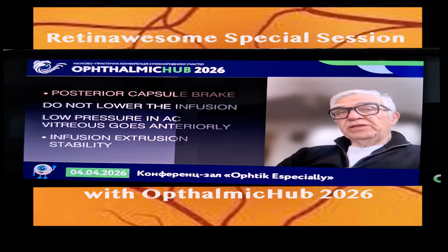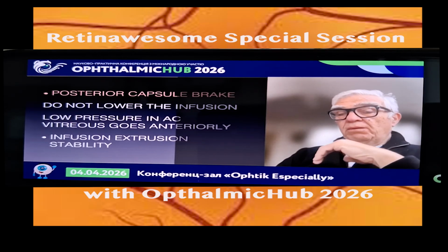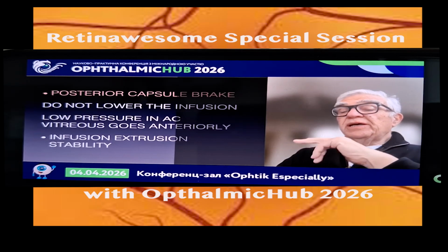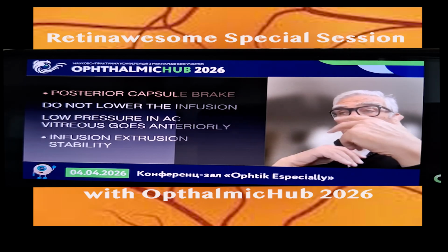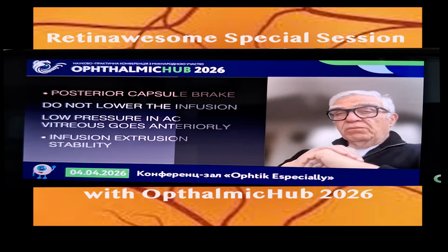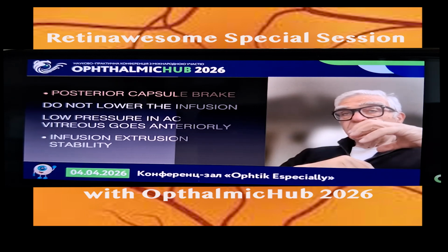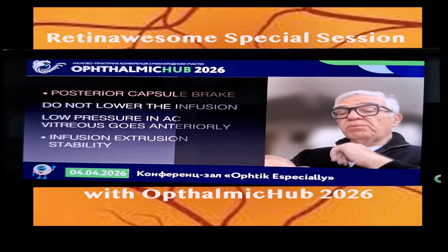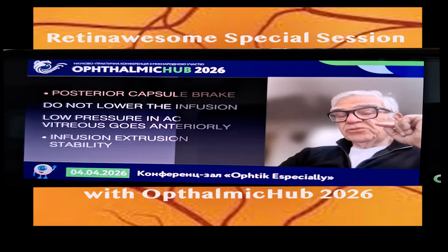The first thing they do is increase the infusion sometimes in order to fill the eye, not to lose anything. But please do not lower the infusion, because with low pressure in the anterior chamber, vitreous from the back goes anteriorly. That's a common physics law, and you cannot fight it with any statistics. So if you lower the infusion from the beginning, then the anterior chamber is going to be less pressurized and vitreous is going to come, although it was not supposed to come if you didn't lower the infusion. So you need the infusion extrusion to understand the infusion extrusion stability.